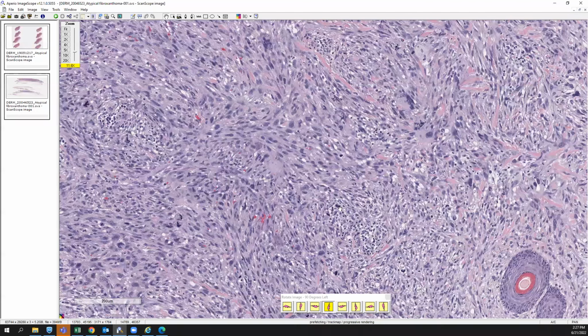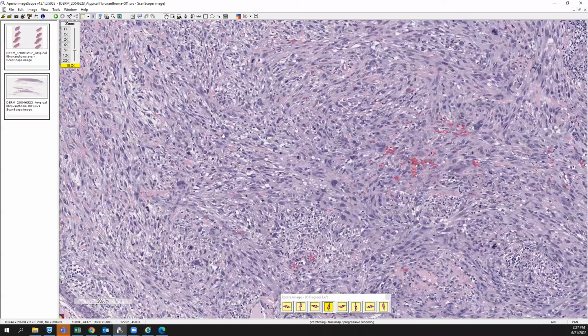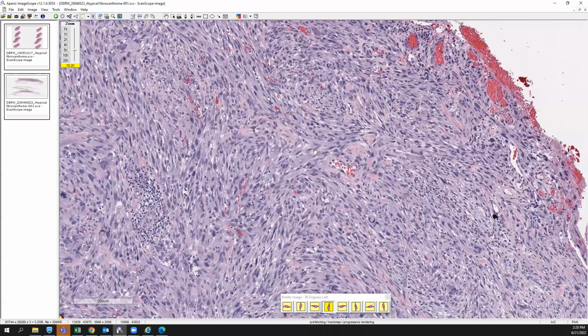Now, if you get under it all, you can essentially call it an AFX, but if you transect it, you're not sure if it's going to be a pleomorphic dermal sarcoma, which are typically more invasive. They've got necrosis. They go down into the subQ. They have a higher chance of metastasis. So if you just get a biopsy that's transected, you're going to have to essentially sign it out as atypical epithelioid neoplasm or spindled epithelioid neoplasm, see comment, and say that the differential includes an AFX, but correlate with the excision specimen. So how do we exclude other diagnoses?